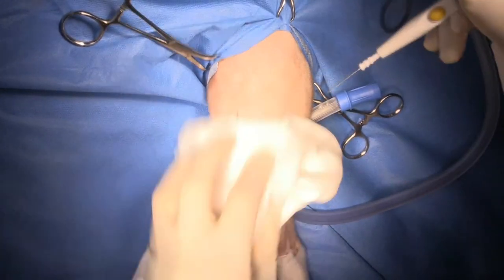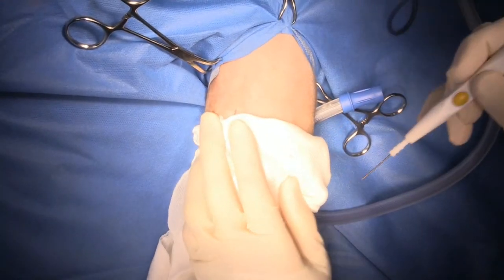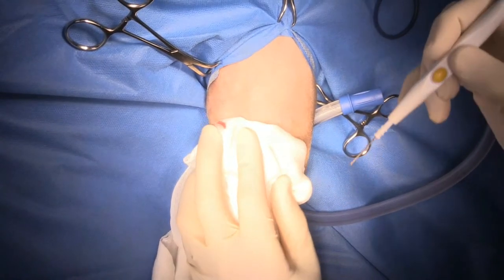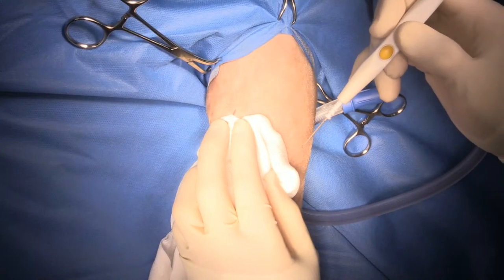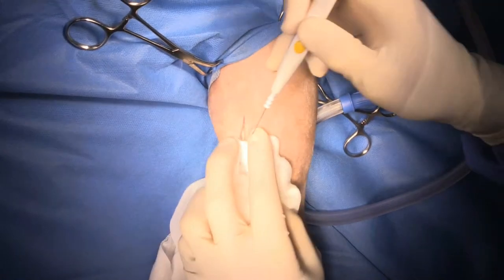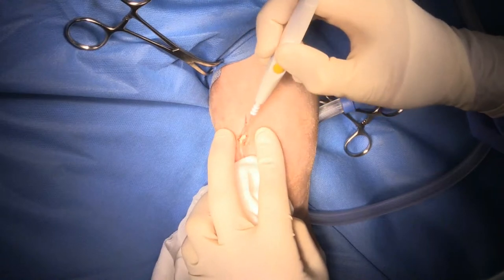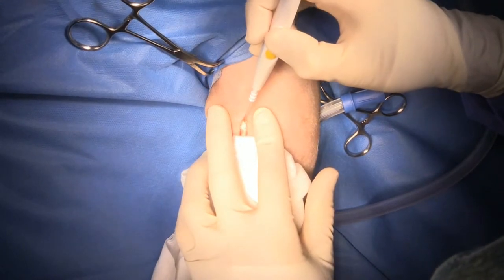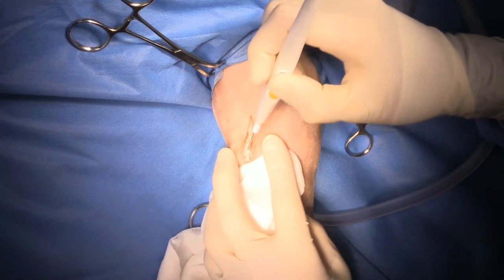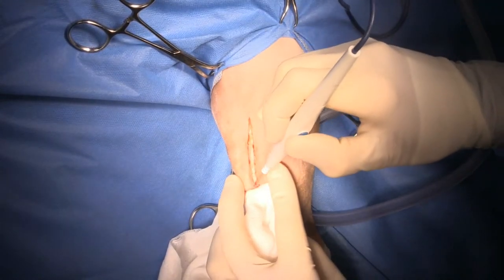A really important thing when you're doing a patella luxation repair is to make sure that you look at the cruciate ligament, because you can have secondary cruciate ligament rupture with patella luxation. If you've got a dog with a chronic patella luxation and it suddenly becomes lame, that often is not because of the patella luxation but because of cruciate ligament rupture.